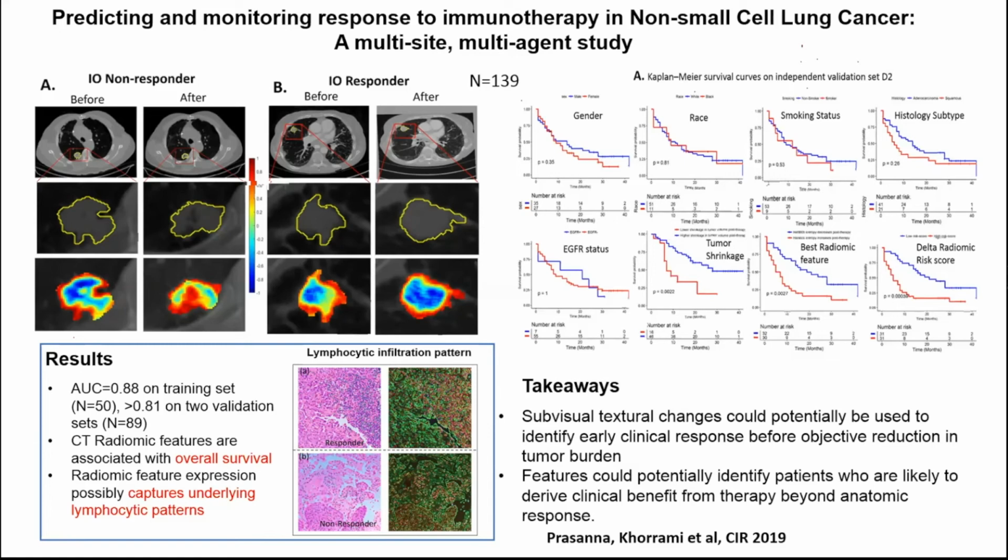So not only were we able to identify a set of features on the radiology images, by connecting it to the pathology, we provided further interpretability and intuition about the meaning of these features.